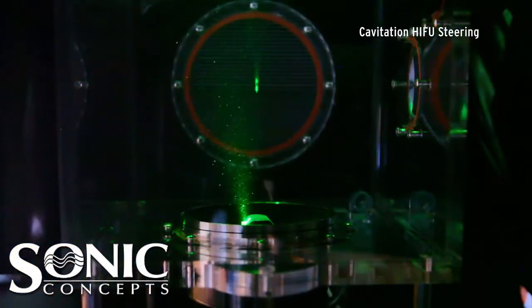The liquid crystal sheet is removed and the green laser now illuminates the water in the same plane. The power is turned up to transmit enough sound pressure to create vapor cavities within the focal region, commonly known as cavitation. The intended focus, represented by the main cavitation zone, becomes very bright.